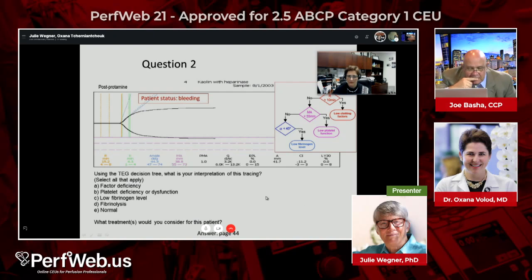So that's the R value's too long, right? I can't read that right there. The green one. What's that right there? It's a little elongated. It's 4.3 with 4 as the upper limit. Okay, so that's also a little long, and yep. The angle seems too shallow to me.